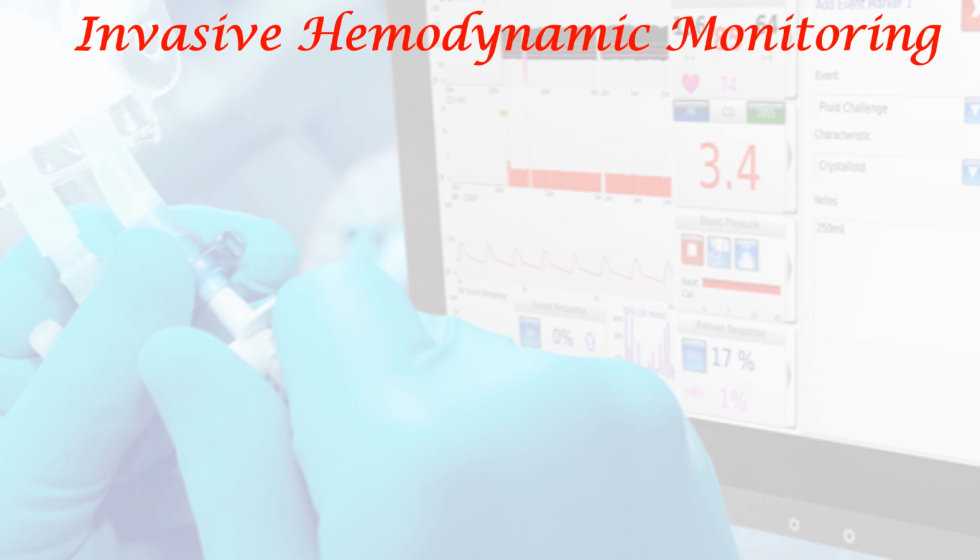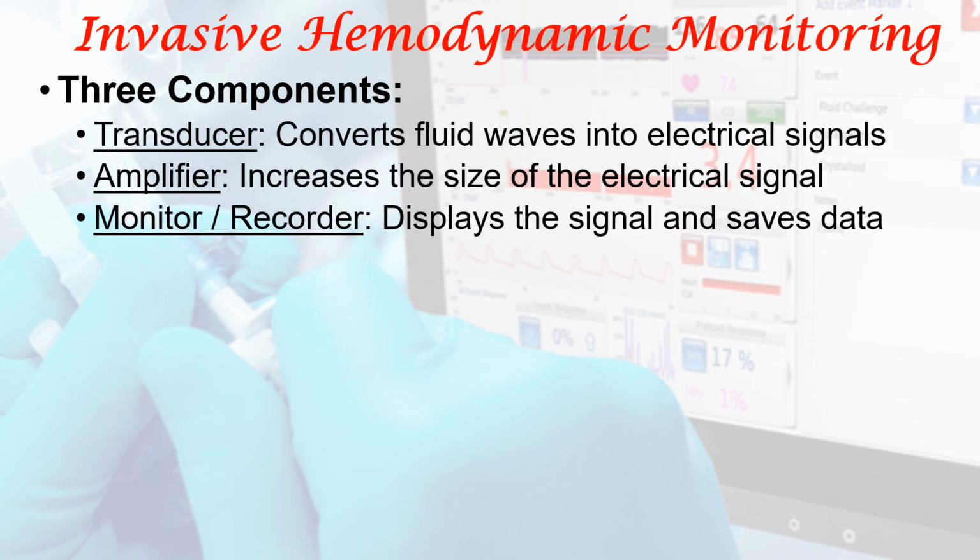Let us see the invasive hemodynamic monitoring in detail. In invasive hemodynamic monitoring, there are three components: transducer, amplifier, and monitor, otherwise recorder. The transducer converts fluid waves into electrical signals, that is the basic principle. Then the amplifier increases the size of the electrical signals, and the monitor recorder displays the signals and saves the data.